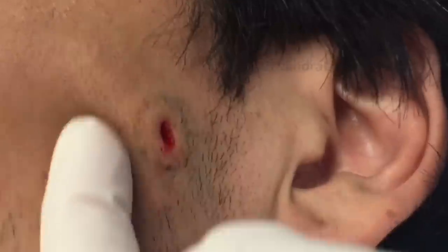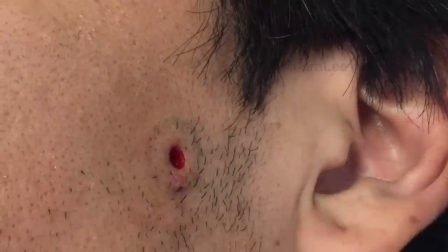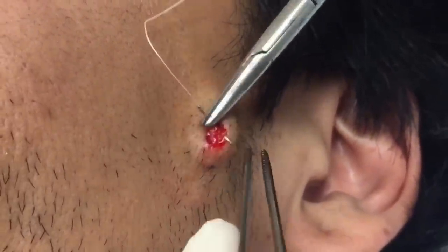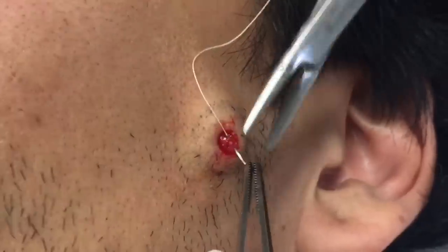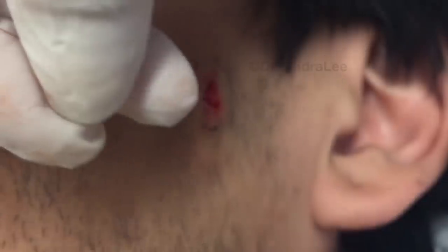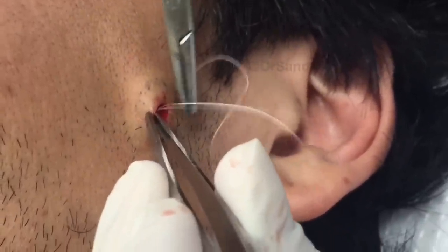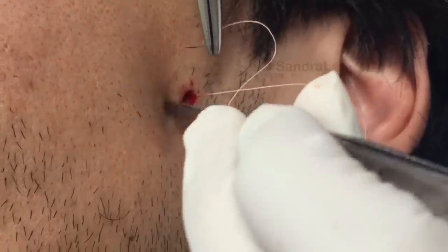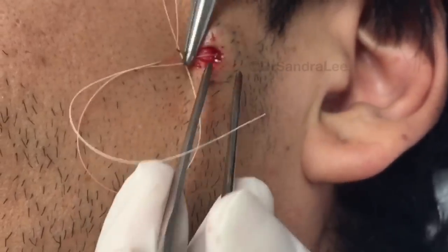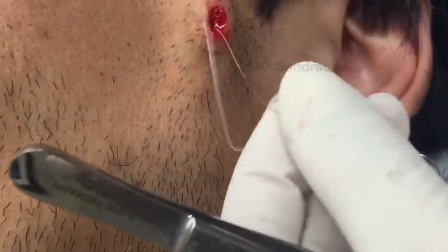Give me a big smile again. That's how we know in what direction to put the suture. We put a couple of stitches right across in that direction. He had it for about six months, and he actually tried to squeeze it but nothing came out. I'm trying to save his modeling career here, so we're going to make this nice and tight by putting a little deep stitch in here. Oftentimes with these punches you don't need to put a deep one in, but just because he's sweet, we're going to do that for him.